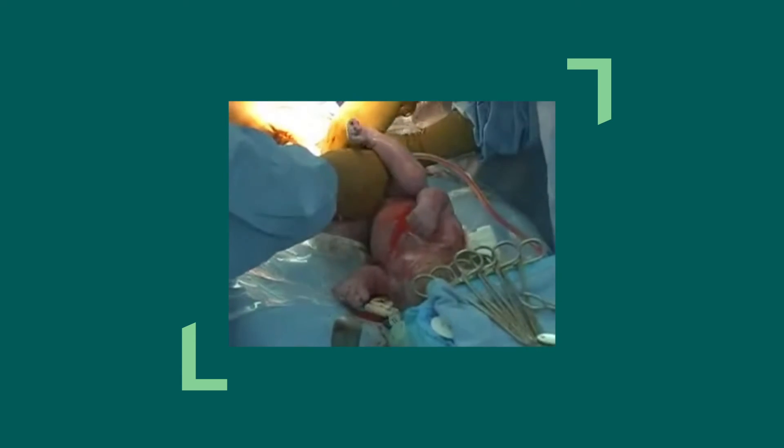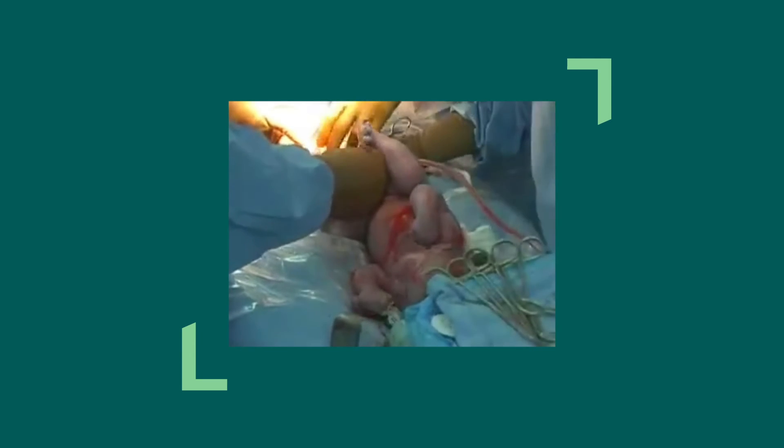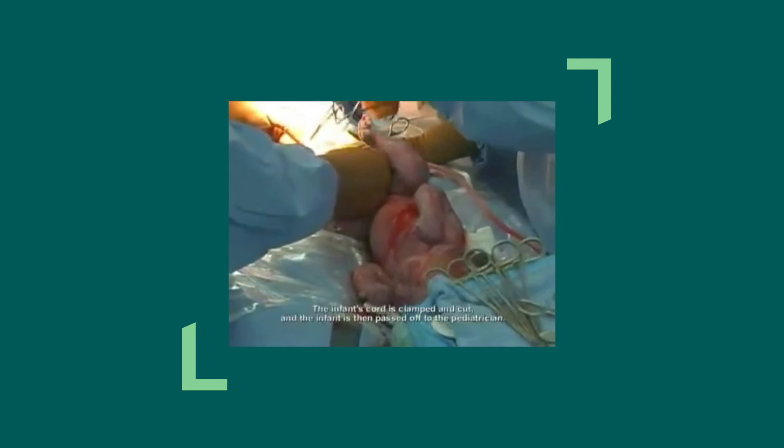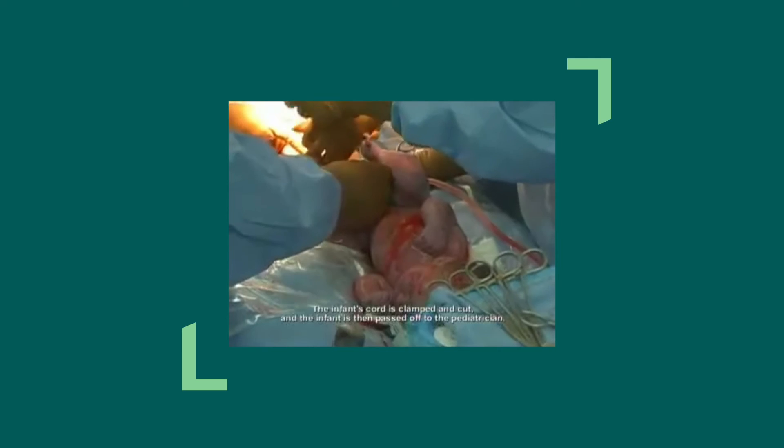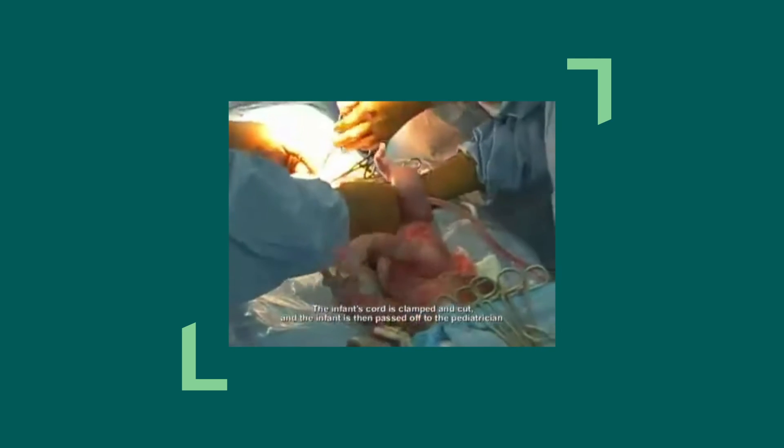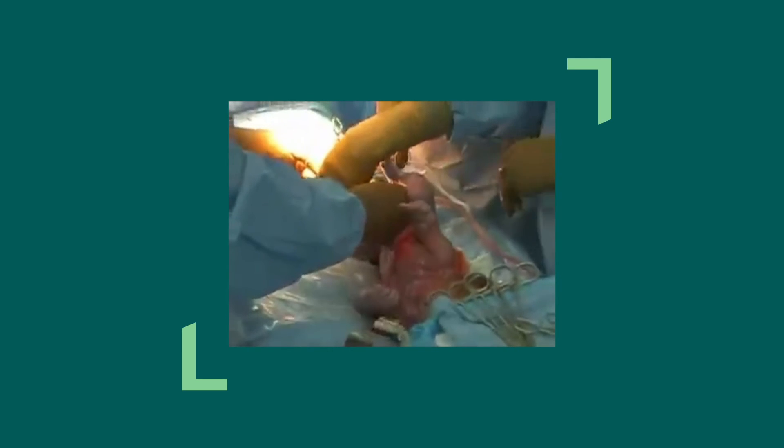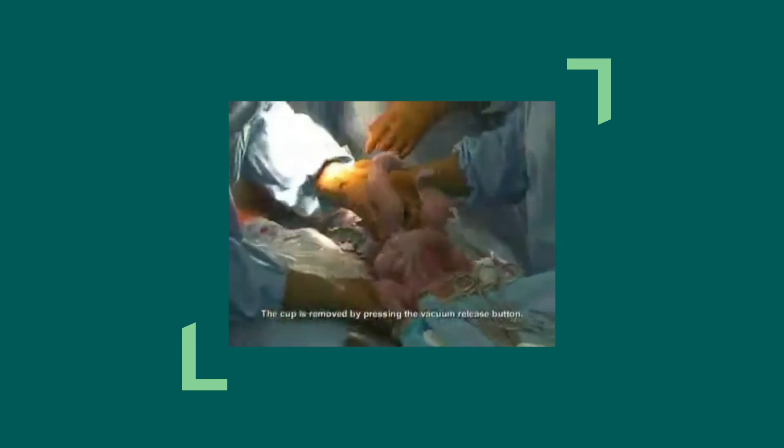After the infant is delivered, the infant's mouth is suctioned. The infant's cord is clamped and cut, and the infant is then passed off to the pediatrician. The cup is removed by pressing the vacuum release button.